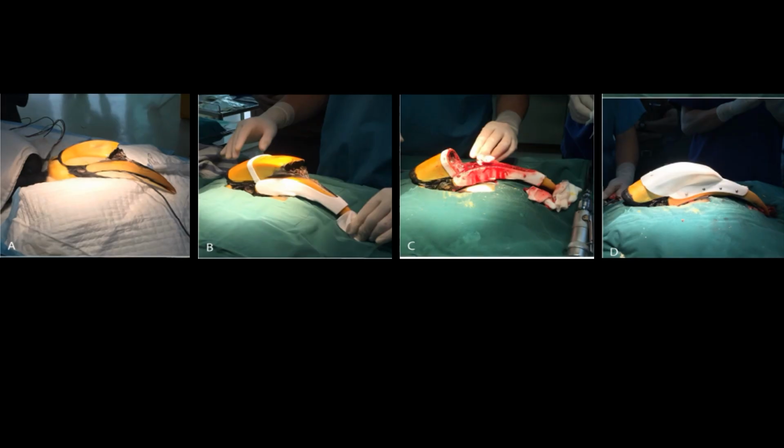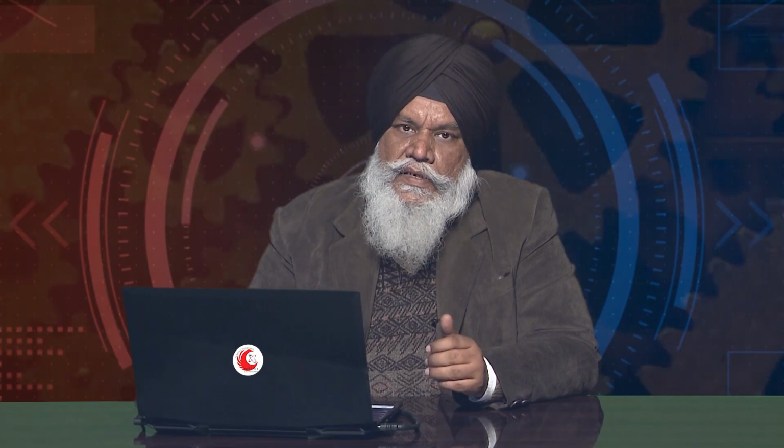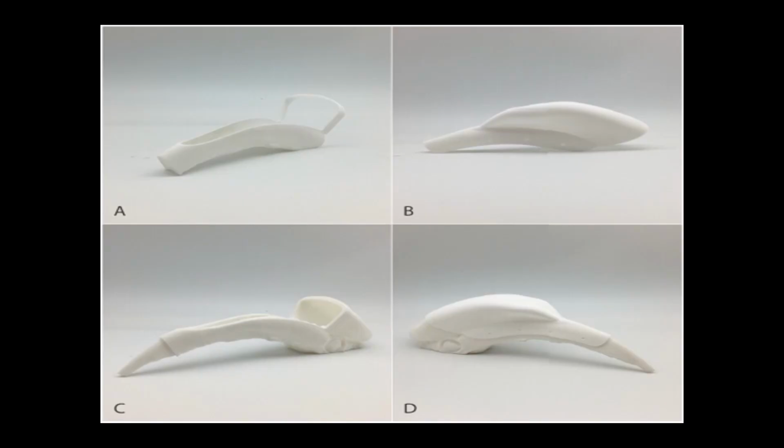Similarly, in another case, for this hornbill, the beak part has been damaged. So just by taking the scan and doing reverse engineering, people have reported the development of this type of beak material. So the basic idea is again, as an engineer, I have to take the CAD file, generate the STL, then 3D print the part and do the assembly.